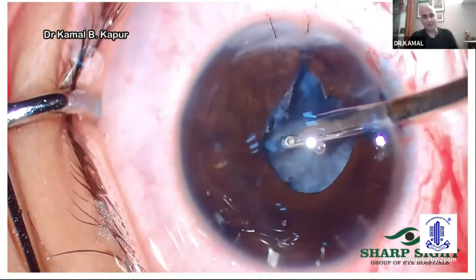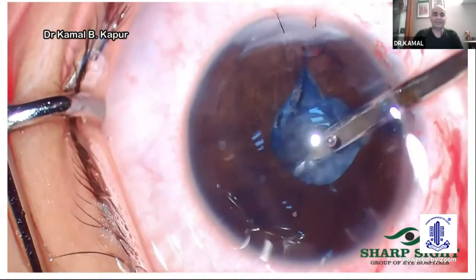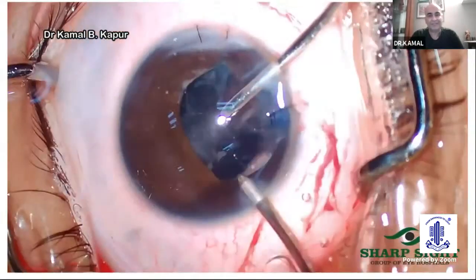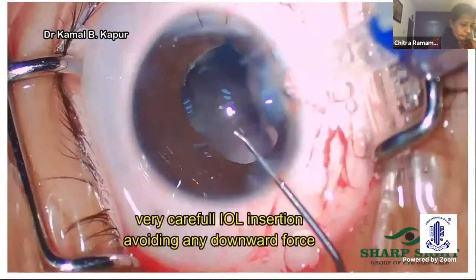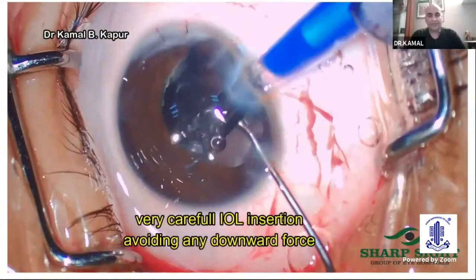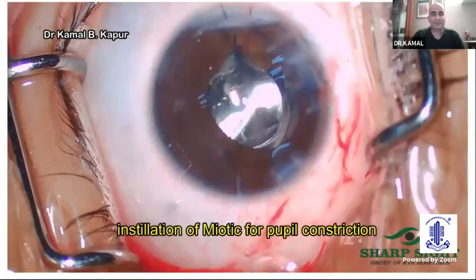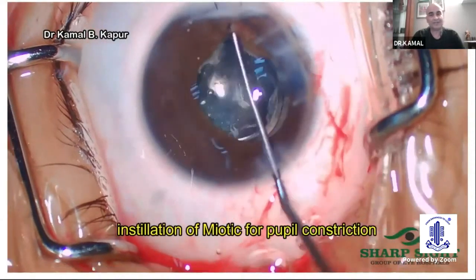Now I use a Simcoe. I do not want to use an irrigation aspiration here because I'm still not sure of the capsular tags which may be there. It's a blind procedure. So once I've done everything, I go and put in a lens. Now I dial it again perpendicular to the axis, which I was presuming is my capsulorhexis.